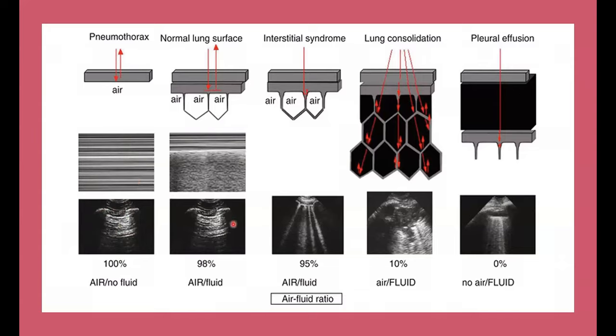Experience says that in babies, most babies will, especially at birth, even if they've aerated their lung, have some element of interstitial fluid. And that interstitial fluid, classically from our perspective, will maybe occasionally give you these comet tail appearances that we saw. You can see them there at the top. You may get anywhere between one to up to three B lines for a few days, and one B line may persist even in children.